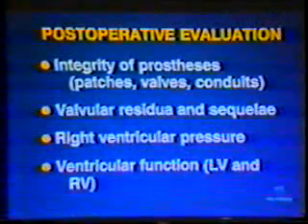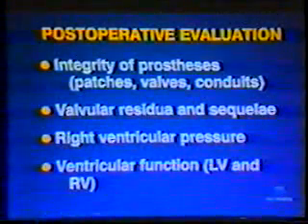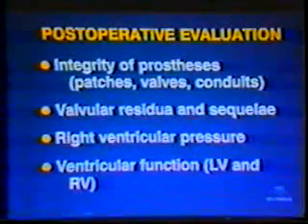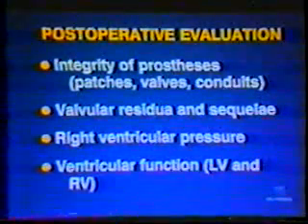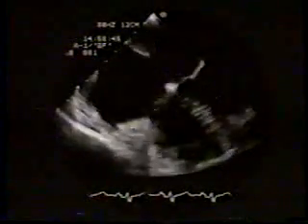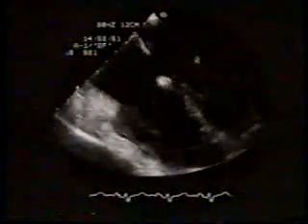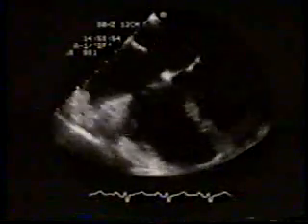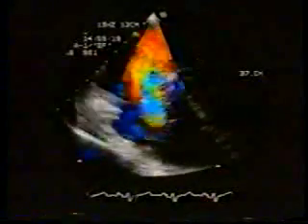In the preceding section, we have tried to emphasize the fact that postoperative congenital cardiac patients have many residua and sequelae of their operations. Hence, these patients require long-term follow-up care by a team of experts. In this tape, we have presented a systematic approach utilizing 2D Doppler and color flow imaging for the assessment of acyanotic, cyanotic, and postoperative congenital cardiac patients. Echo Doppler evaluation has had a major impact on the care of patients with congenital heart disease.